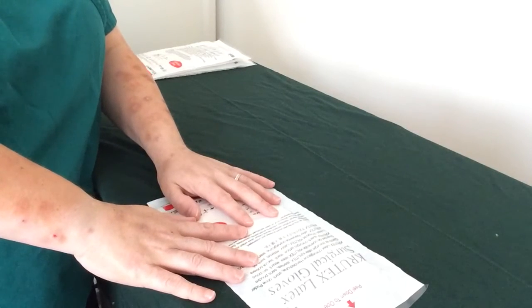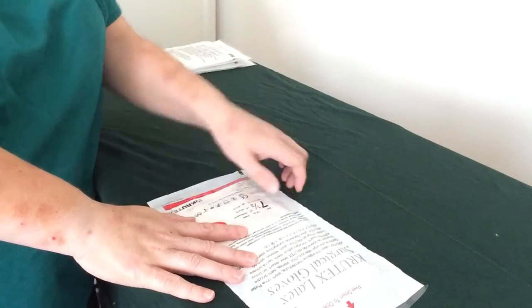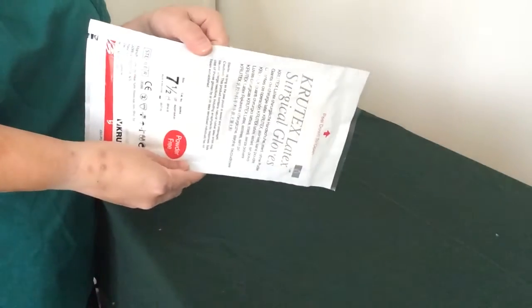It's Jane RVN and we have another OSCE Tips video. This time, you've probably guessed, we're going to do some gloving.